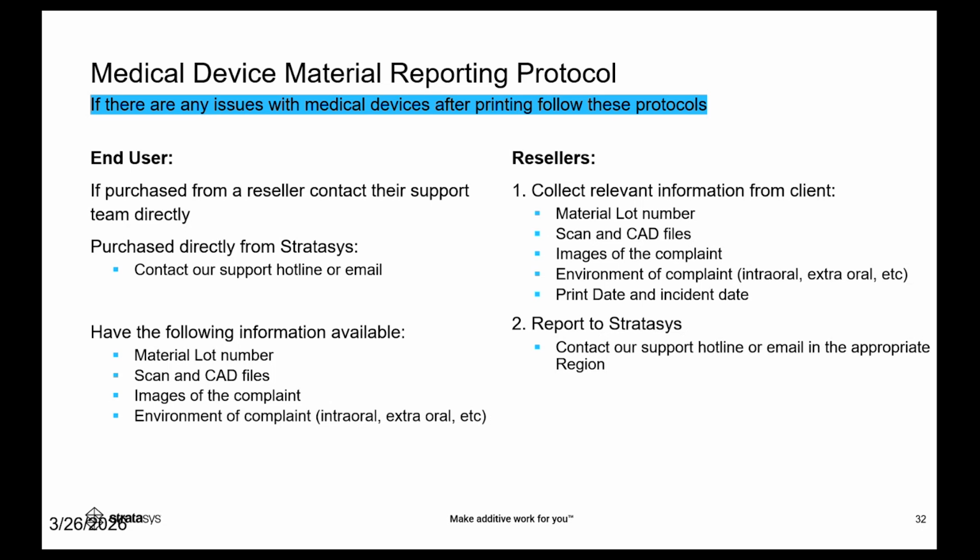Please. Yeah, Adrian, I just wanted to touch on one thing that Adam mentioned about how important it is to clean our machines after each and every print. If you're doing any kind of DLP printing, you realize it does take time to remove our print parts from our plate, throw them in alcohol, clean our print plate, and then refill our vat with material. When Adam's talking about cleaning after each and every print, we're not talking about 5 minutes. I typically spend 30 to 40 seconds to clean my printer after I'm done printing, and I do most of the time 2 prints a day, so I have a lot of practice at it.